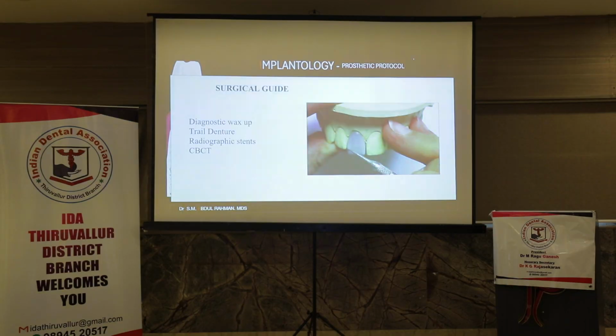சரி, இந்த மாதிரி ப்ராசஸிங் பண்றதுக்கு என்ன பண்ணணும்? ஸோ மெயின் திங் நம்மளோட ஃபர்ஸ்ட் நம்ம இனிஷியலாக போடும்போது பிரச்சனையே ஆங்குலேஷன் அண்ட் பொசிஷன். இந்த ஆங்குலேஷன் பொசிஷனை நம்ம அவாய்ட் பண்ணிட்டோம்னாலே 90% ஆஃப் இம்ப்ளான்ட் ஷுட் பி சக்ஸஸ்ஃபுல்லாக இருக்கும். அதர் இது காம்ப்ளிகேஷன்ஸ் இருக்கு, ஐ வில் டெல் யூ. ஸோ டு அவாய்ட் that situation we have to use the surgical guide.